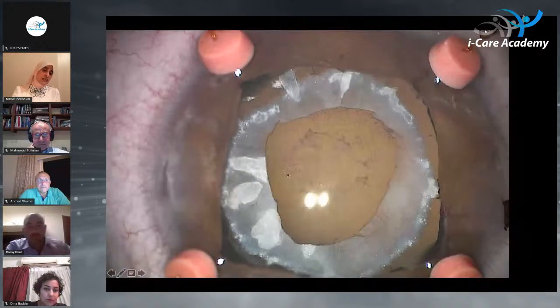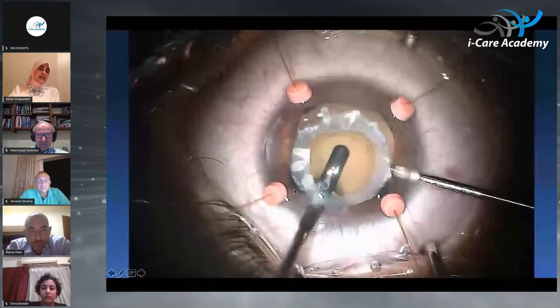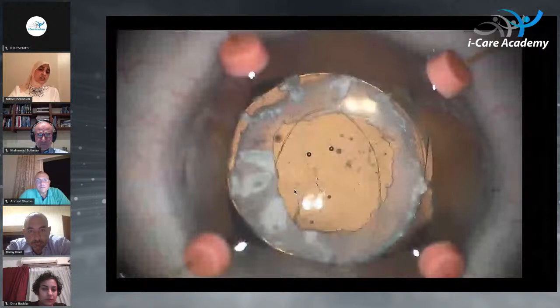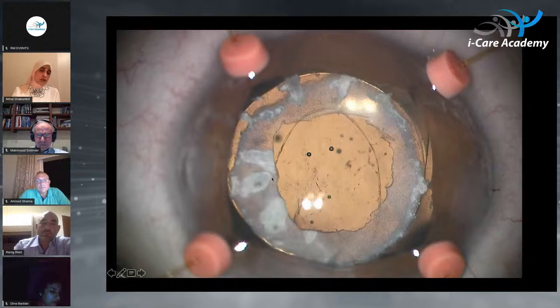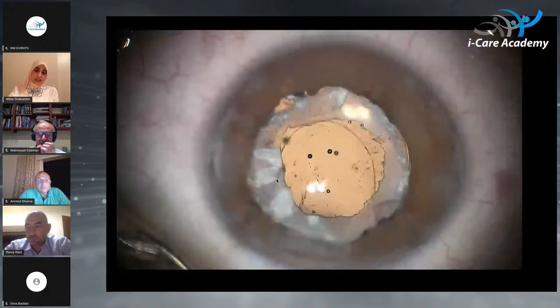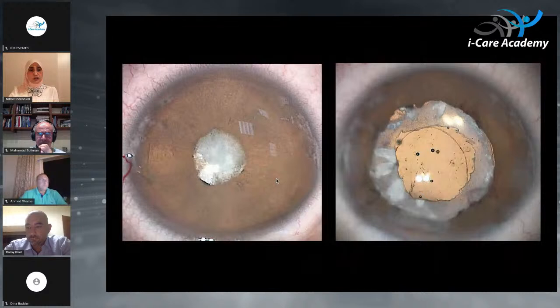There is opacification even in the posterior capsule, which we commonly see. And again, vitrectomy, posterior rexis and vitrectomy, and injection of the IOL inside the capsular bag, despite having a fibrotic anterior capsule. Again, if you do not implant inside the capsular bag, it is going to lead to drastic complications after surgery. Here at conclusion of surgery, and this is before and at conclusion of surgery.